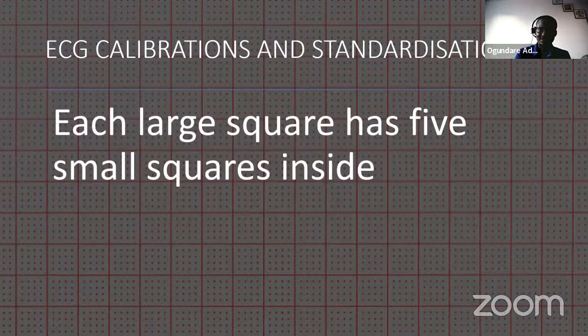Another important part of the calibration that you need to know is each large box has 5 smaller boxes inside. If you have an ECG paper with you, you see the thick lines, which are the big boxes, the big squares. Inside the big squares, there are smaller squares. So a big box has 5 smaller boxes inside.